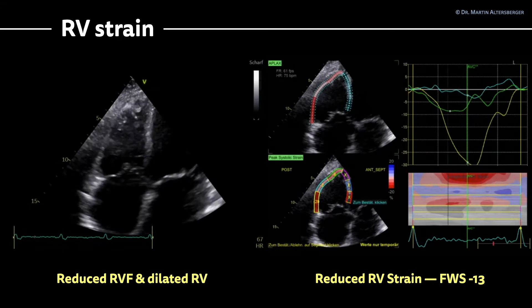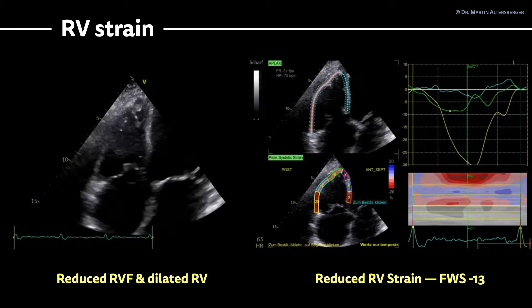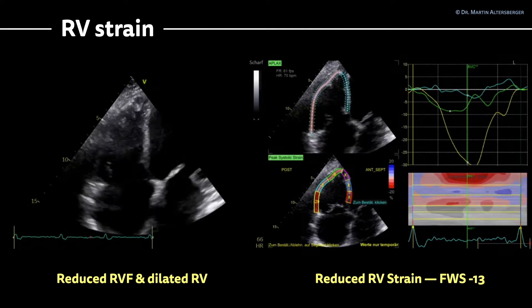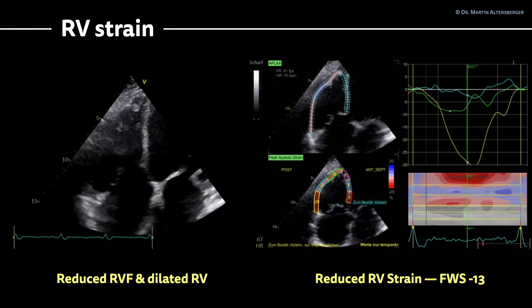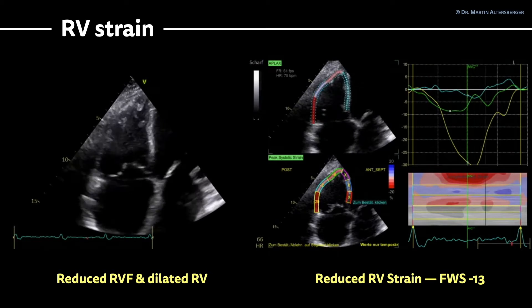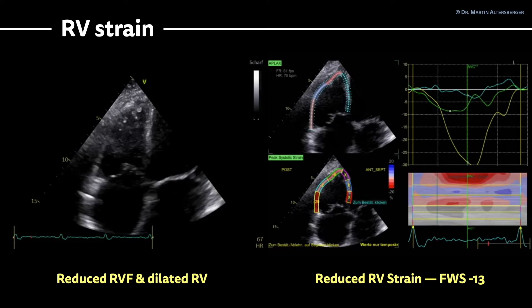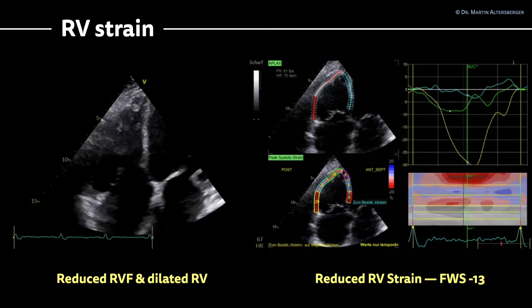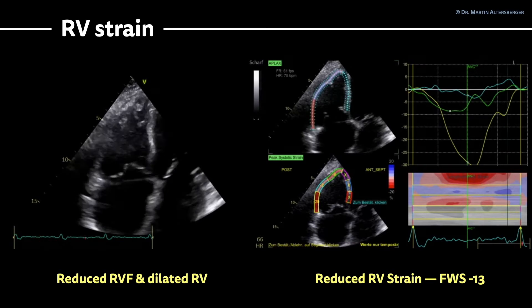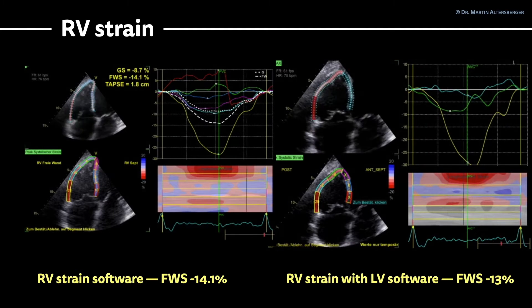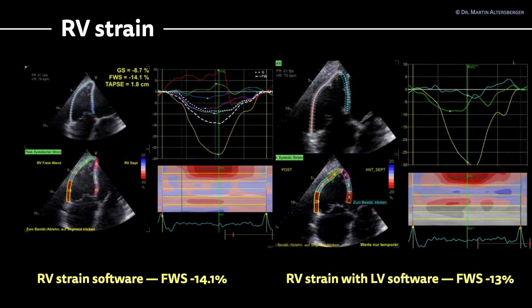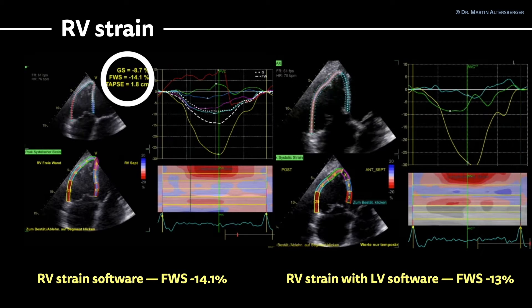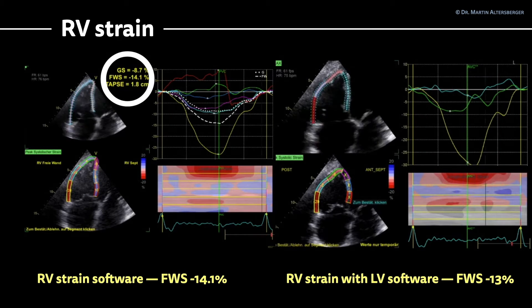Moving on to right ventricular strain — as shown in the first part of this case — you can use left ventricular strain software to evaluate the right ventricle. Here, I used an apical long axis software to grade the RV strain imaging. The overall free wall strain, meaning the mean value of the three segments of the RV free wall, was minus 13. The B-mode image also confirms that RV function is reduced and the right ventricle is dilated. When performing RV strain imaging with a designated RV strain software, the free wall strain is minus 14.1 — approximately the same value as calculated with the LV software.